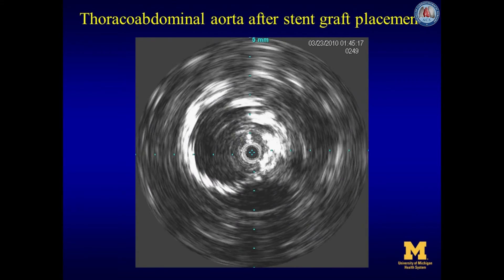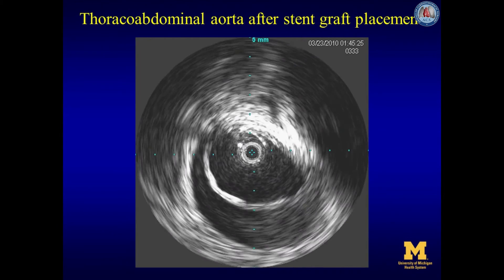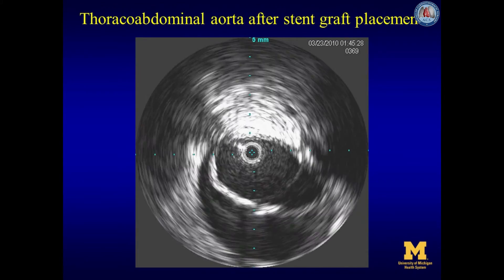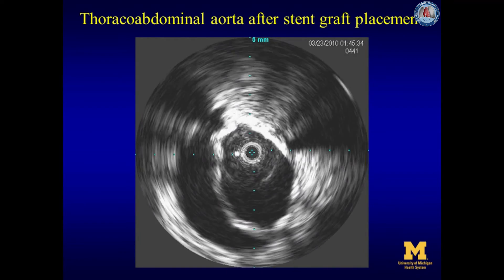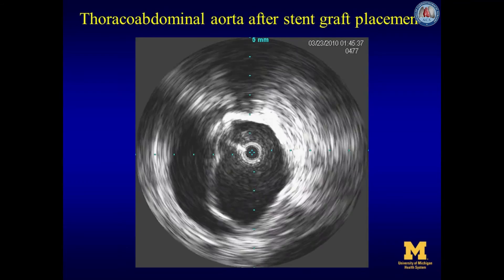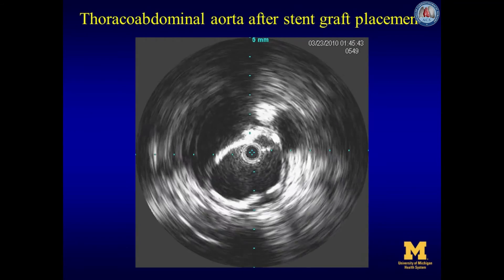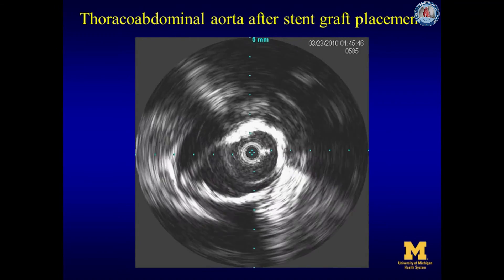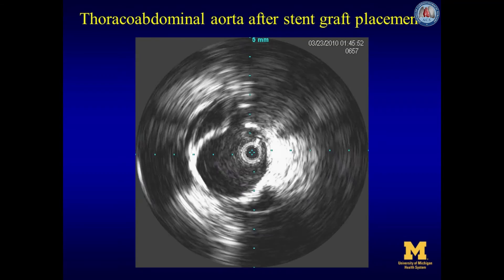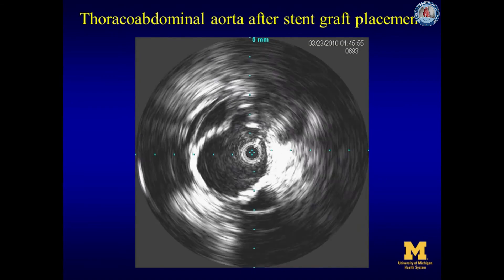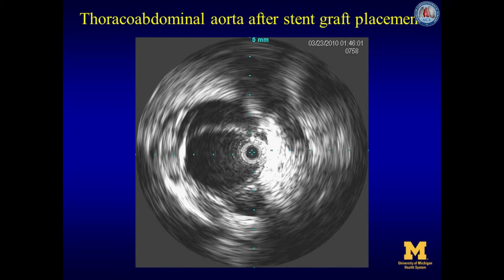The abdominal aorta true lumen is now expanded, including the previously almost totally collapsed portion seen on pre-treatment IVUS. The celiac artery comes off at 1 o'clock and the superior mesenteric artery at 12 o'clock. The right renal artery comes off at 12 o'clock and the left renal artery at 5 o'clock. The infrarenal aorta true lumen is also expanded.